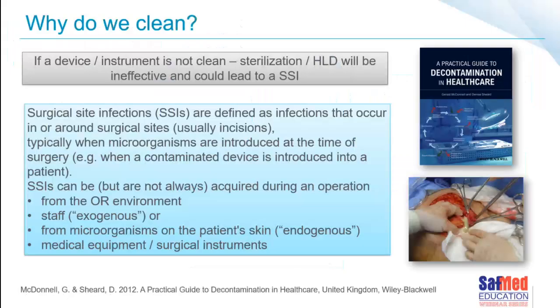As we, I hope, all know by now, if a device or an instrument is not clean, the next step in the process, be it sterilization or high-level disinfection, will be ineffective. And that, of course, can lead to a patient developing a surgical site infection.